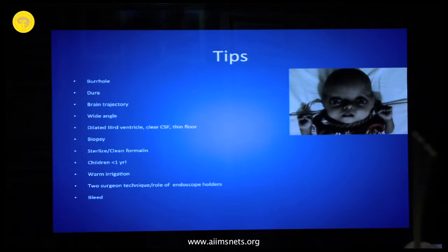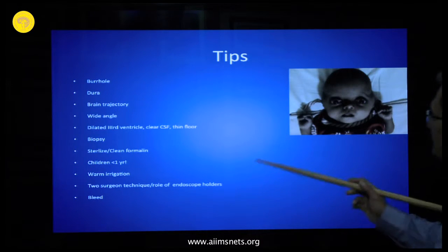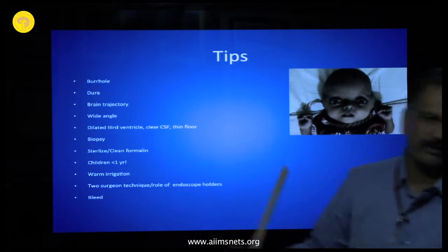I thought sometimes we all have a problem. One is, when you're making a burr hole, all the usual concepts aside, one important thing we forget sometimes is to put a lot of bone wax on the burr hole and the dura. What happens is a little blood trickling down from there into the ventricle while you're actually going into the ventricle. It makes the whole CSF completely hazy.